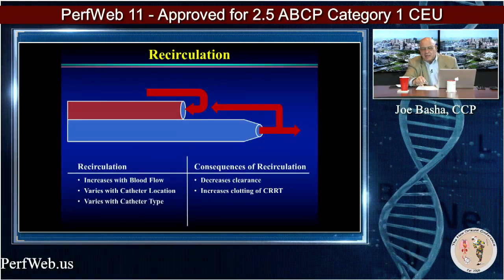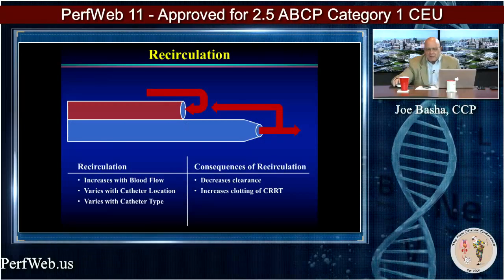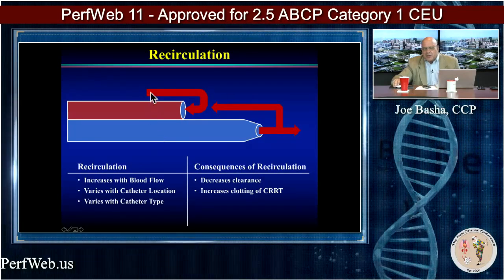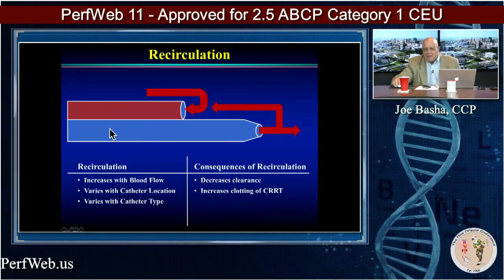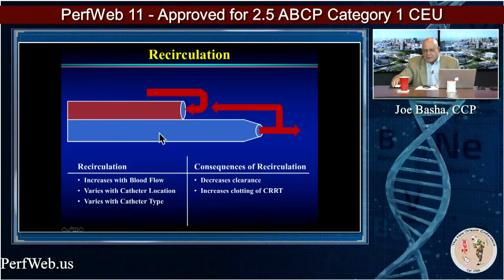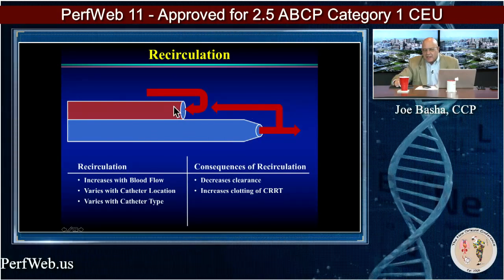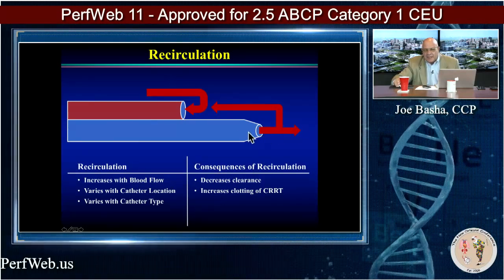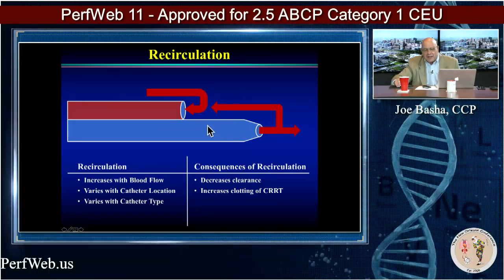Because sometimes you're in the ICU, you have one of these catheters in, and you are trying to go ahead and leave that image up so we can go over that image. But you'll reverse them. You'll make the access blue and the return red. Well, you can easily see what's going to happen. Even with the access red and the return blue, you're going to have some blood come back this way. But if you have to reverse it to keep it running and you're accessing from here and returning here, whoa, it's just going to switch right back in there like that.